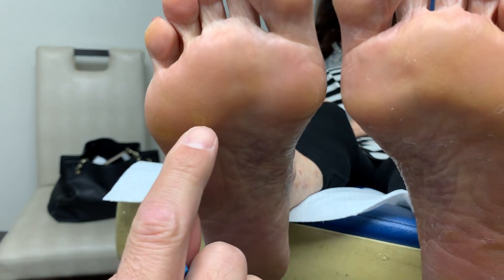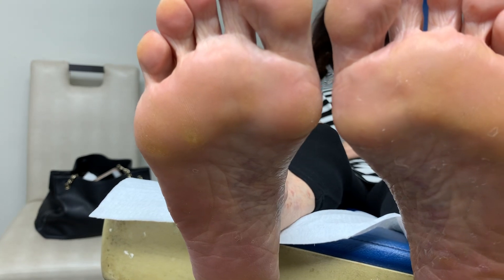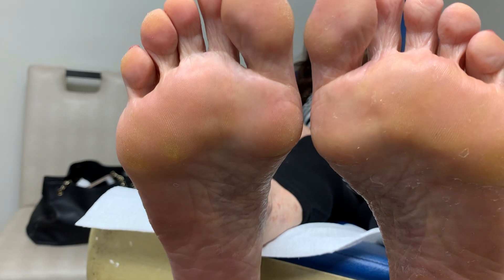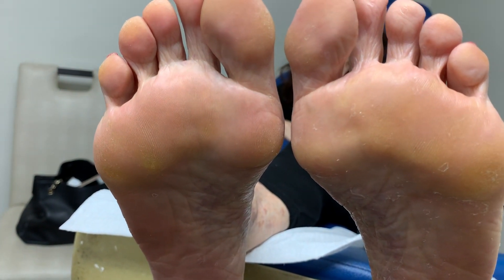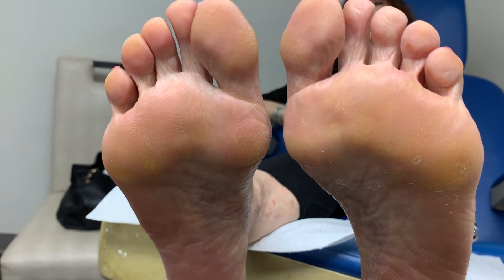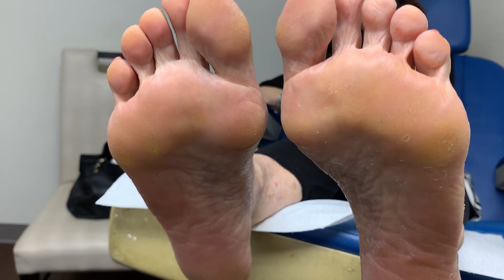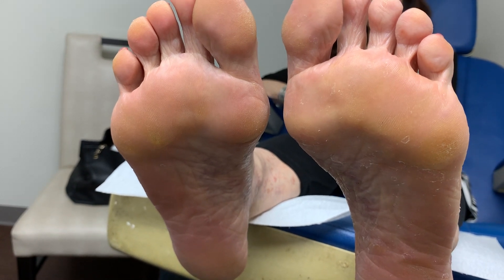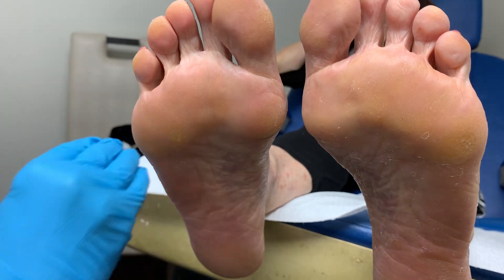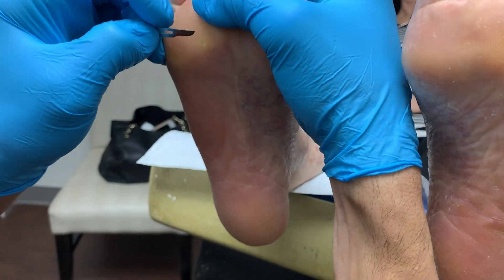Let's get a really nice close-up there. So there it is. This is not really bothering her, but it may not seem like such a big corn. Historically, the real painful ones are the ones that are really compact, and the deeper they are or go, that's where the real pain comes in. I apologize in advance, like always, and here we go.